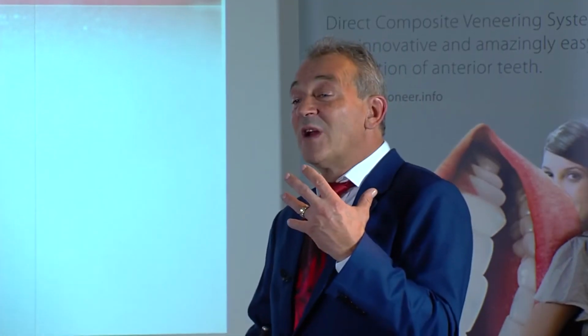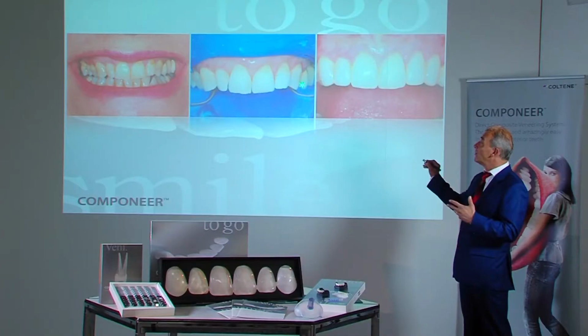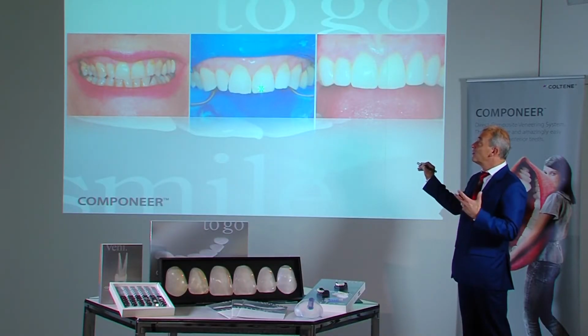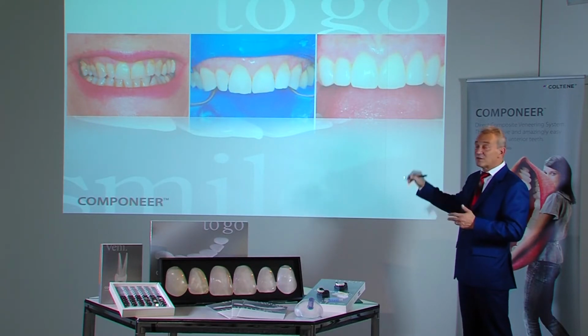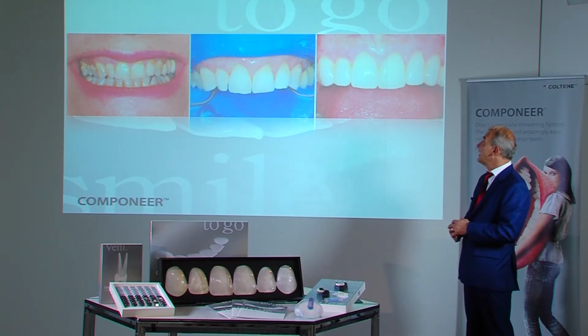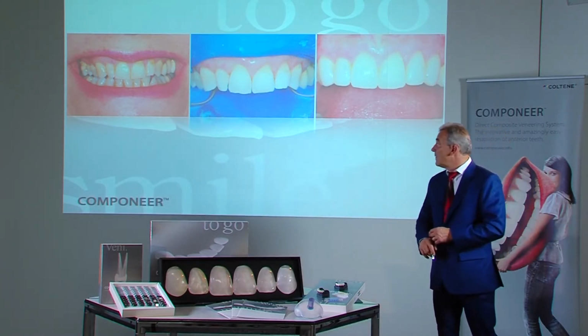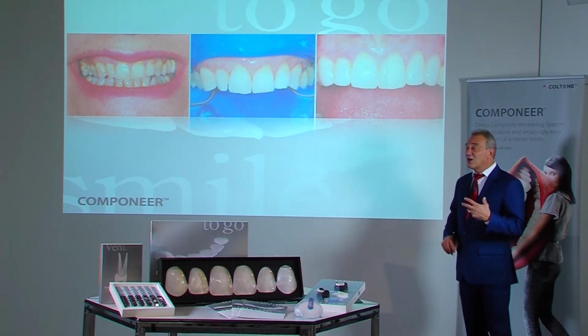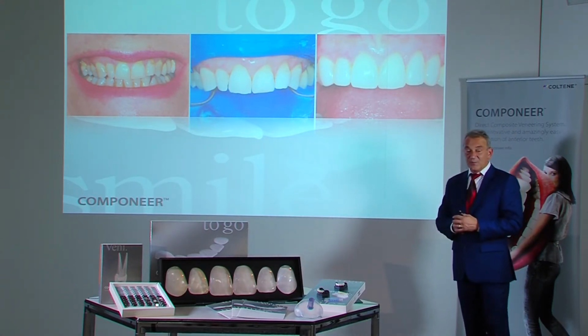In this case, all we need to do is replenish. This is why it's sufficient to only clean and condition the tooth surface. The presence of enamel gives a frosty white appearance. This confirms that etching has been performed. The primer is used for dentine. As no major background corrections are necessary, we can place Componeer directly using the same restoration material from which the shells are made.